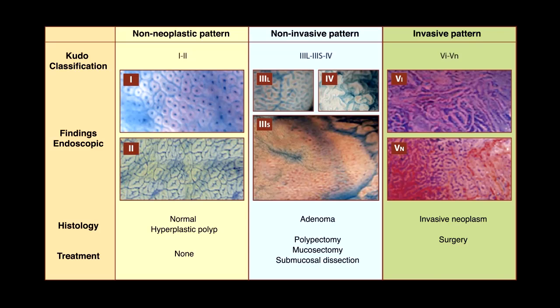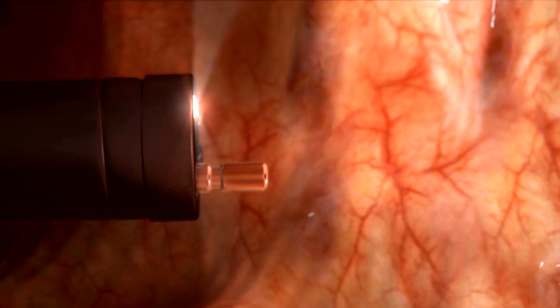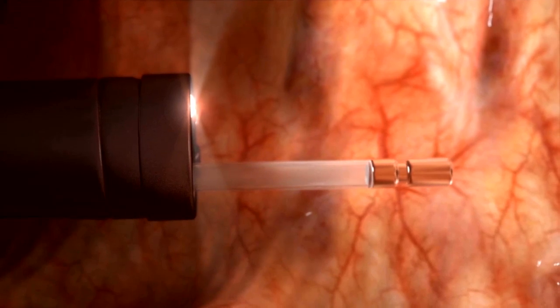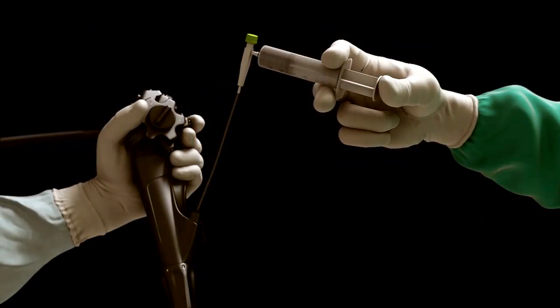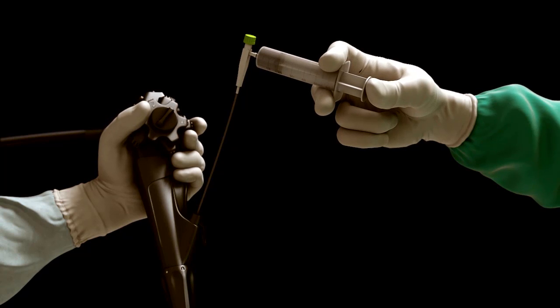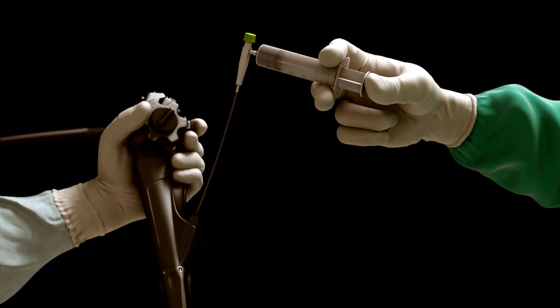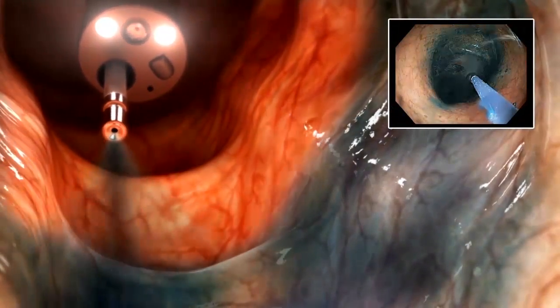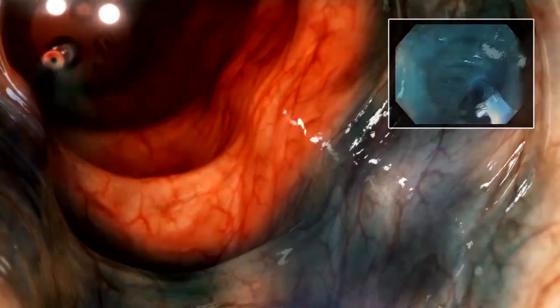The most used application is the spray catheter. The catheter is inserted until it sticks out 2 or 3 centimeters from the tip of the colonoscope. The syringe is handled with constant and firm pressure, creating a narrow layer of dye while the endoscope is removed in a spiral motion. The stained mucosa is assessed in 20 to 30 centimeter sections.